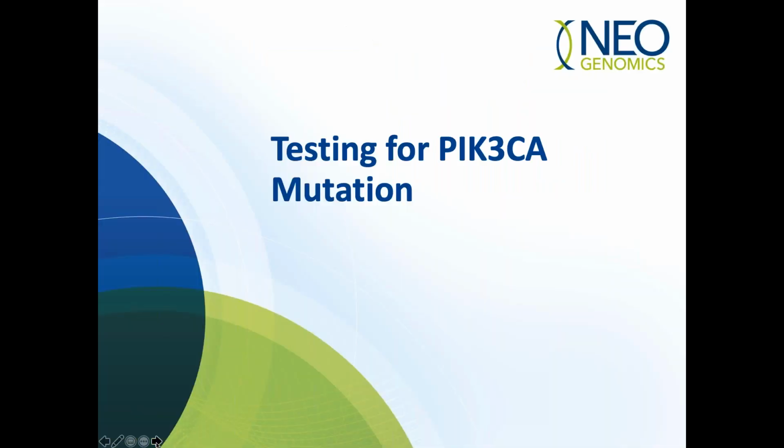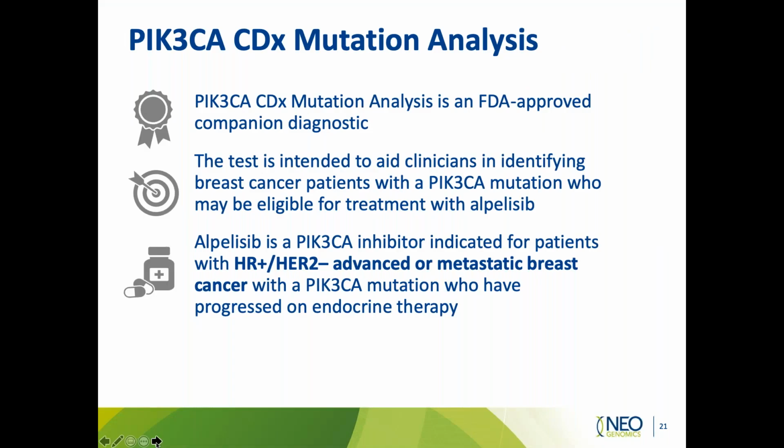So how does one test for PIK3CA mutation? Well, how it should be tested is through PIK3CA CDx Mutation Analysis. It is an FDA-approved companion diagnostic.